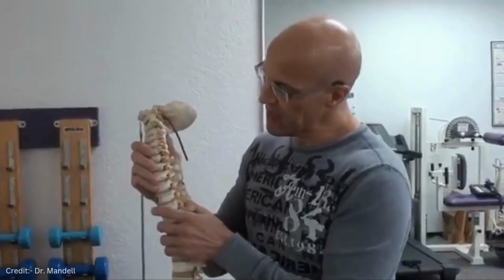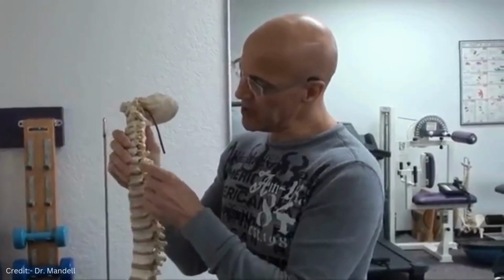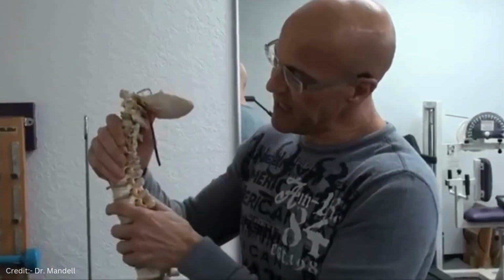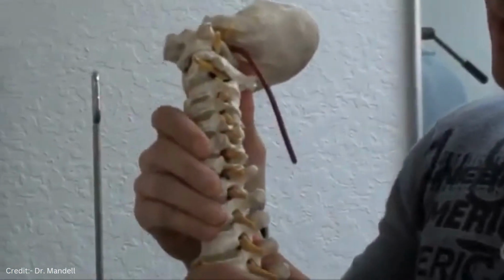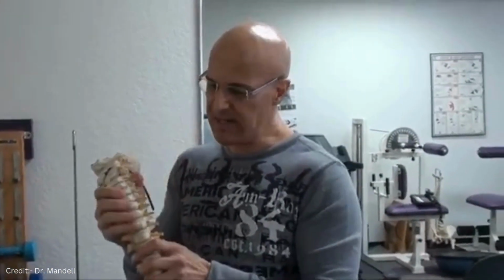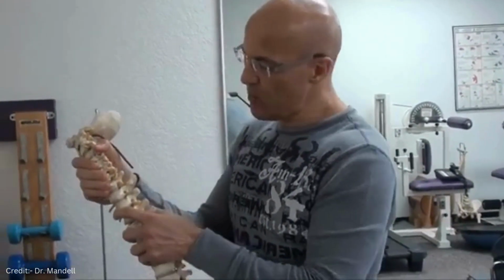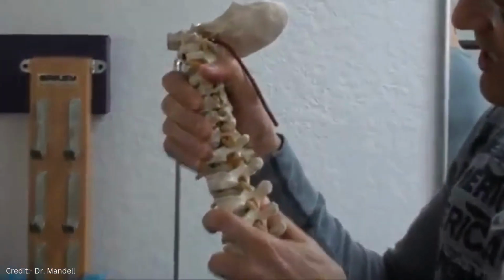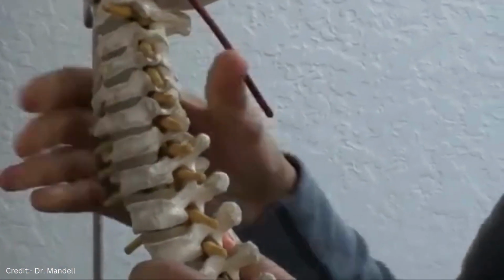If there is compression on a nerve here, and we have irritation on that nerve, our objective here is to decompress. And by decompressing, we want to open up, if you can look here, how it stretches, we're opening up the pressure off the nerve root.